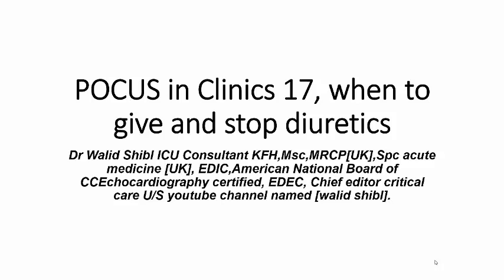Really, the use of point of care ultrasound in clinic is great. It helped me a lot in the management of my patient. You will see in this series of point of care ultrasound in clinics, in this patient, how to accurately and professionally decide when to use diuretics, when to escalate, and when to stop diuretics in your patient, with objective meaning, with visual management.